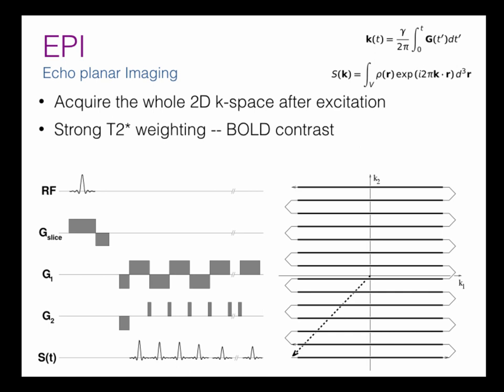And it turns out that the image contrast is largely dominated by the data you acquire at the center of K space. So the contrast you perceive in your image, if you remember the picture of Abraham Lincoln earlier, is very much dominated by the signal when you get to the center of K space.